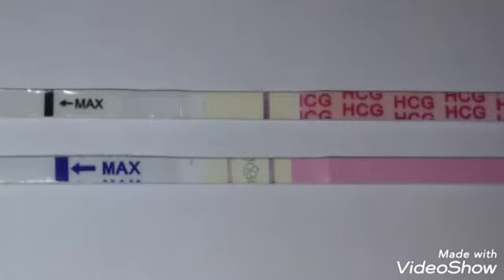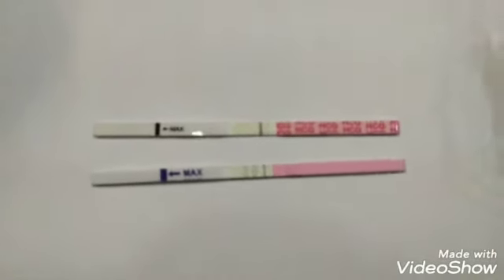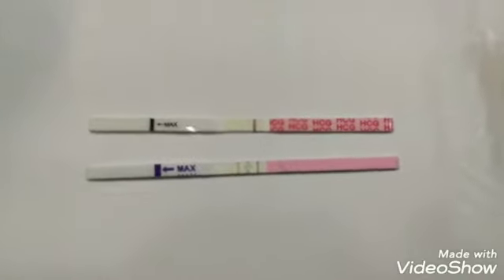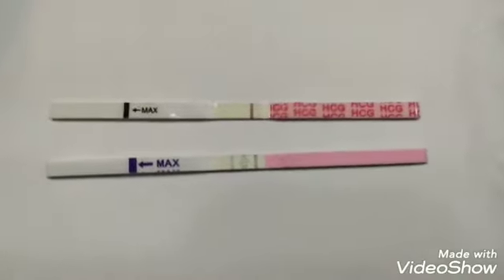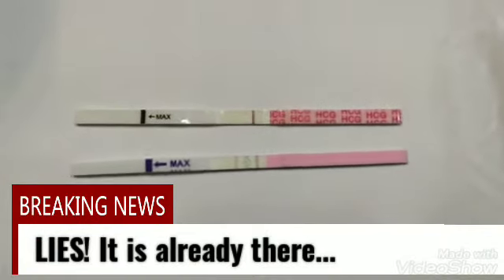I'm going to flip it around so you guys can see the test strips. Okay, so here are yesterday's test strips, and if you guys can see, I was really surprised because that is pert near positive on that OPK, which is the bottom one. I do like on the David brand, that little flower does not show up initially. That's kind of one of their control things to let you know the urine has passed by.